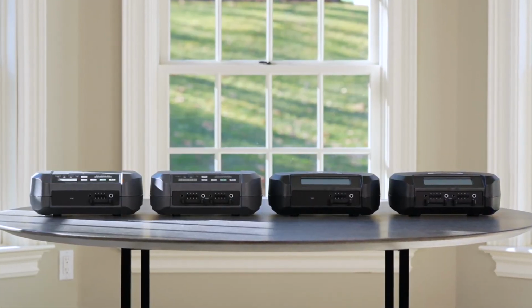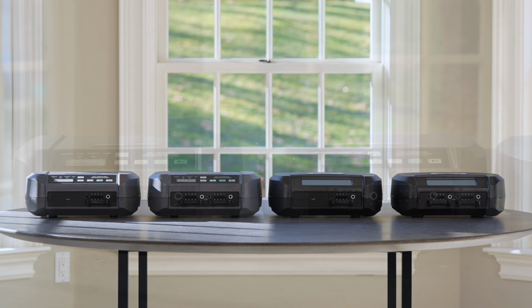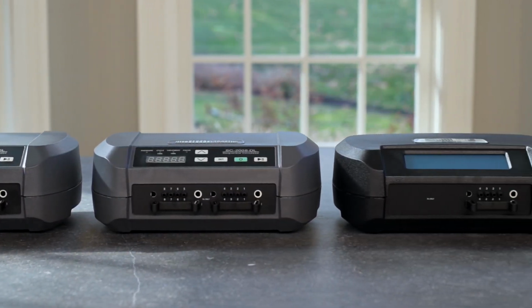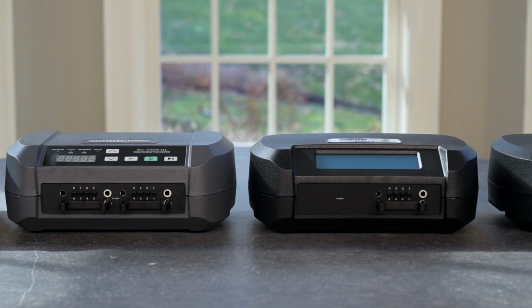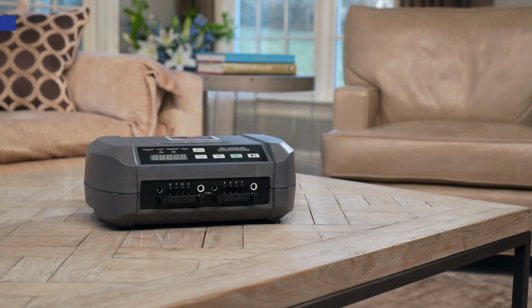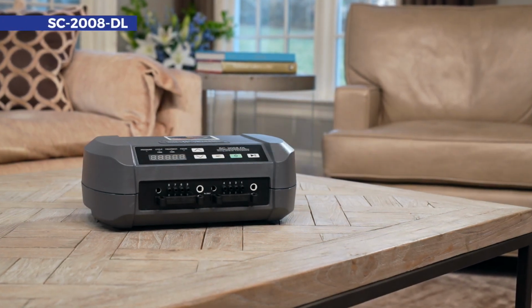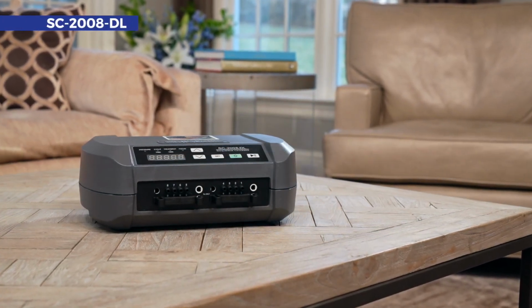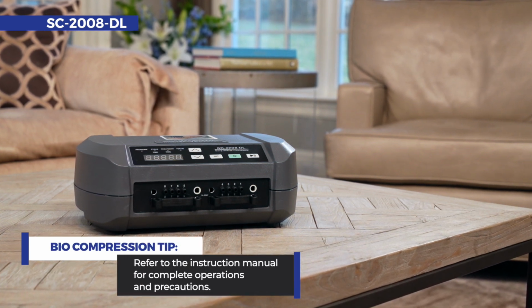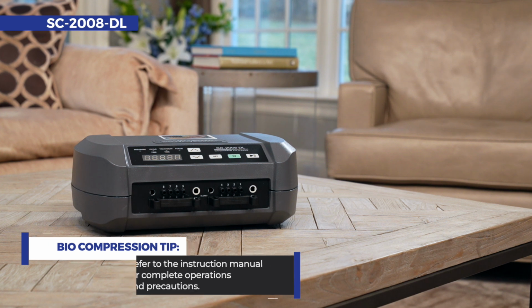Your physician has prescribed a biocompression sequential circulator for your treatment. All of our pumps are designed for home or hospital use. This video will guide you through the setup of the 8-chamber sequential circulator SC2008 DL from start to finish. Always reference the instruction manual for a complete understanding of operations and precautions for your pump and garment.